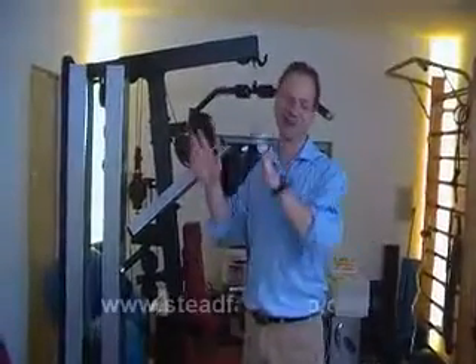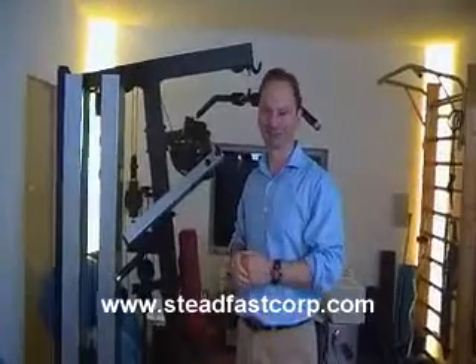So anyway, a simple demonstration, but I hope that gives you an idea. Thank you.